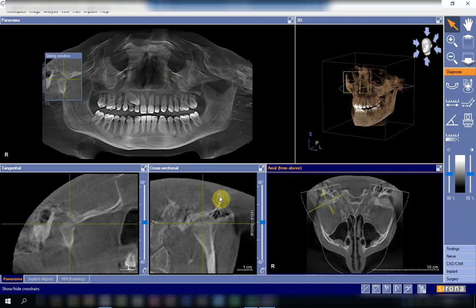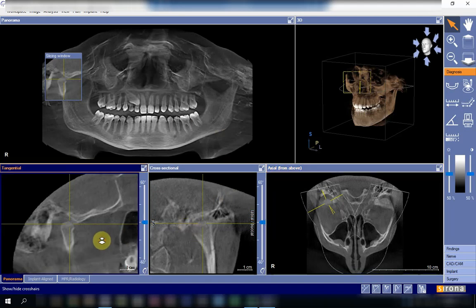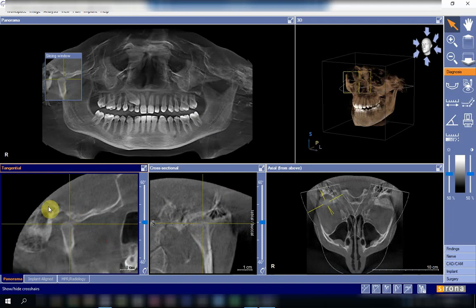We cannot build anything like what the patient feels, or what are the signs and symptoms. These are all for the patient to tell, and for the detailed clinical examination. However, if we are interested or we want to investigate the soft tissues in this area, whether the muscles or the cartilaginous discs or their attachments, then we should think of either MRI or the CT scan.